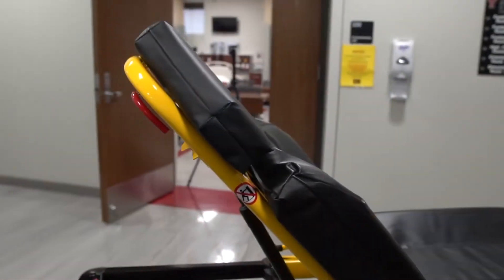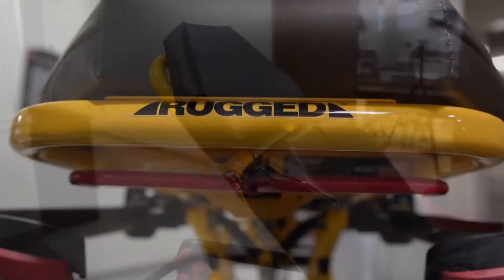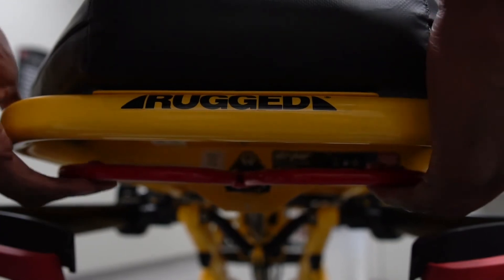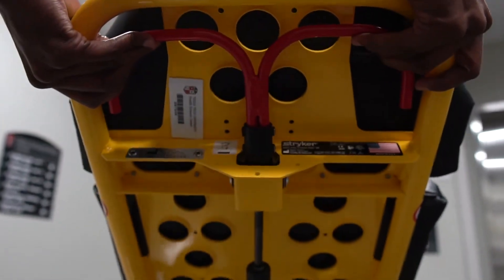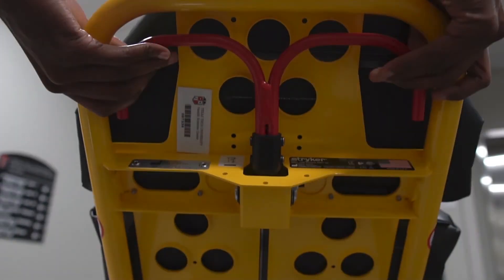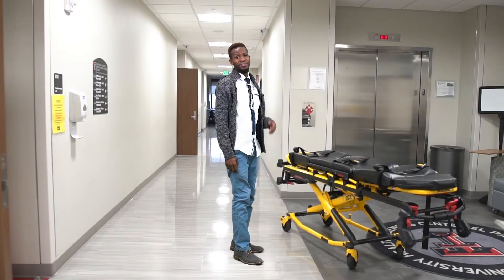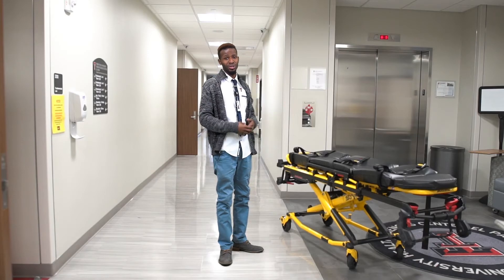You're also able to adjust the torso section of the Stryker. To do this, just grab and squeeze the red handles as you lift. And to bring it down, just reverse the raising process. And that is the Stryker stretcher.